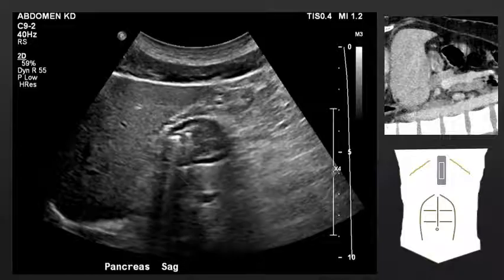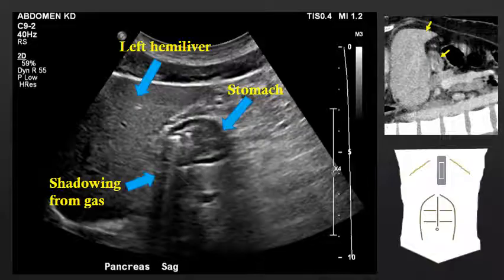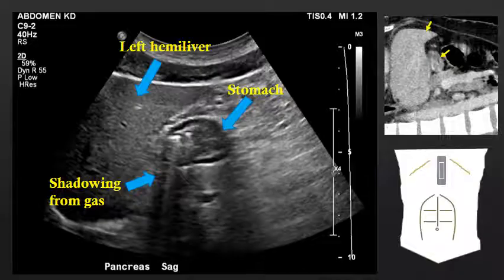If we move to the left of midline, we will again see the left hemiliver, and just deep to it, we will see the stomach running under the margin of the liver. Notice the stomach has shadowing. That shadowing is caused by gas within the stomach, which does not allow penetration of sound waves beyond it, and therefore causes a hypoechoic appearance deep to the gas, otherwise known as shadowing.